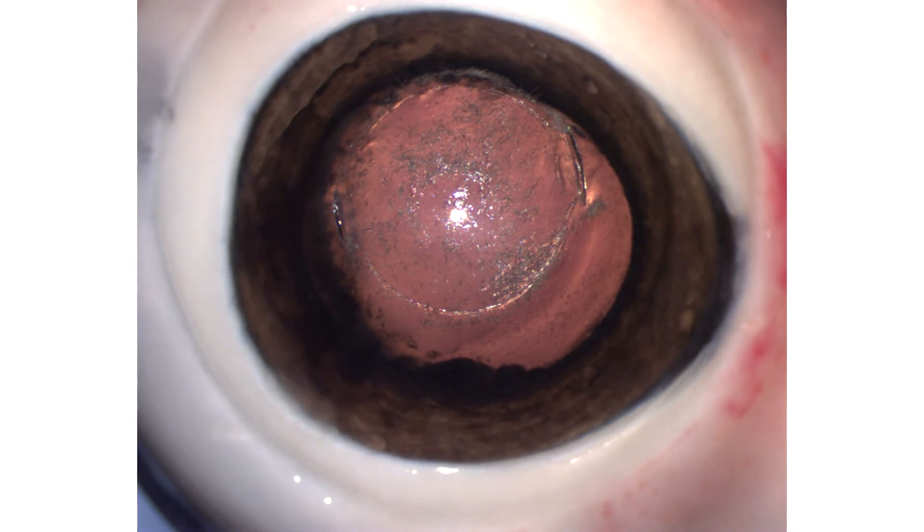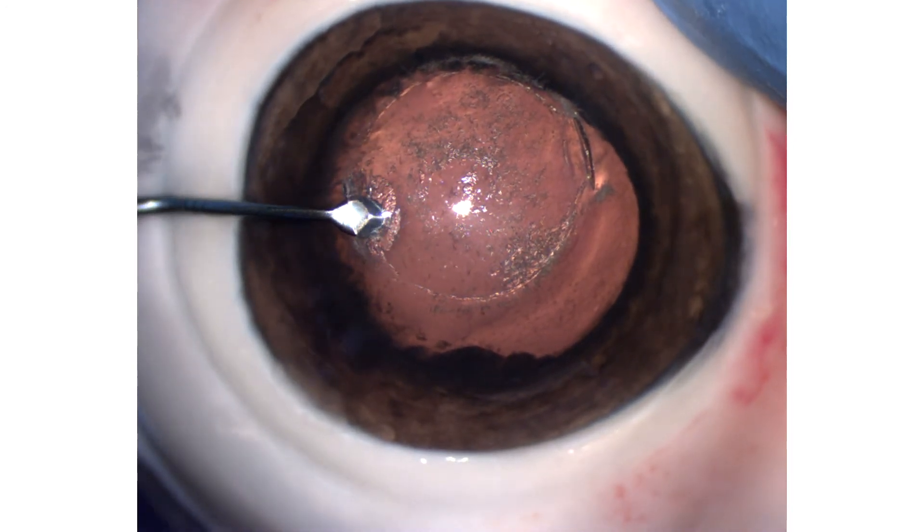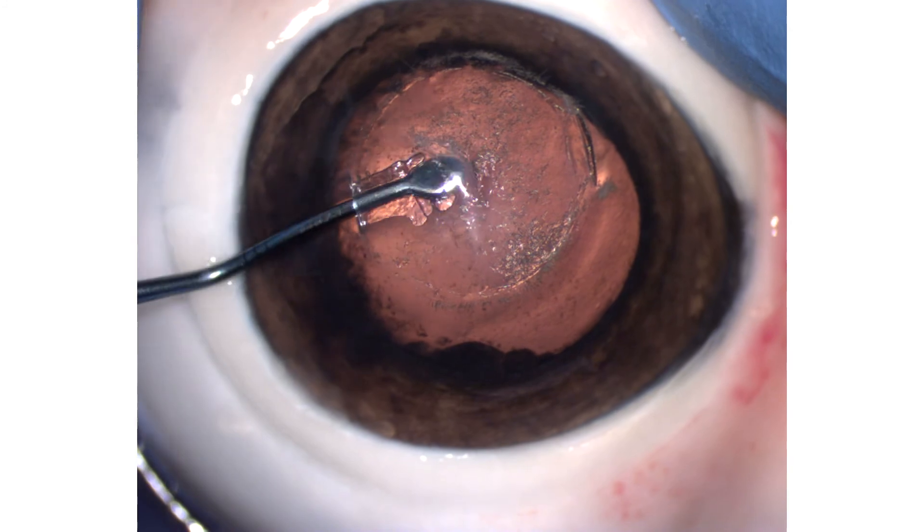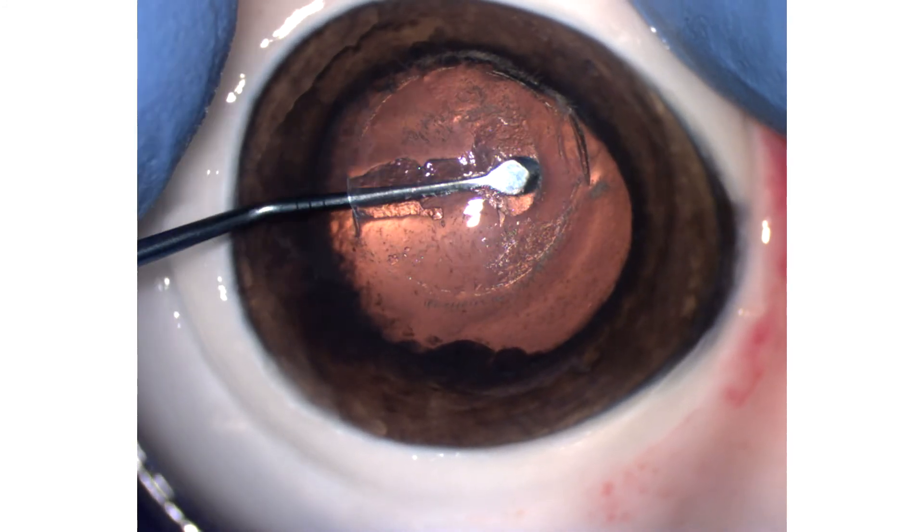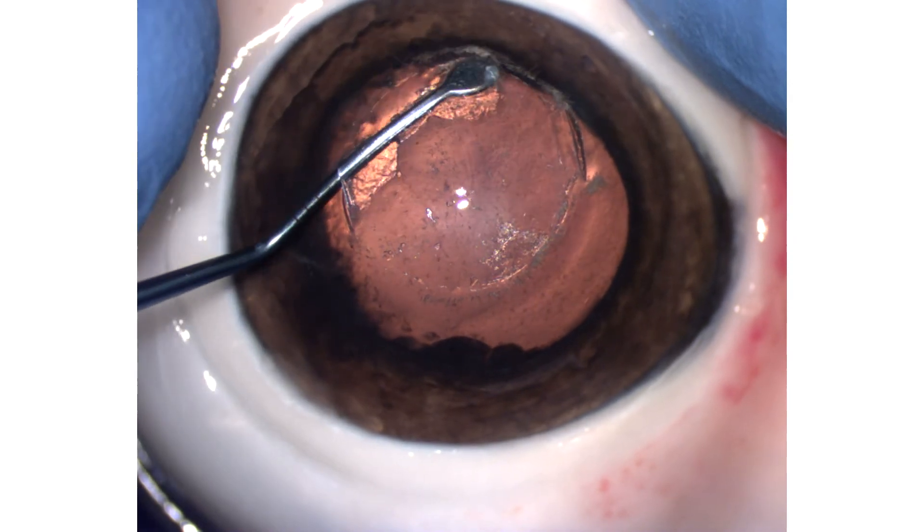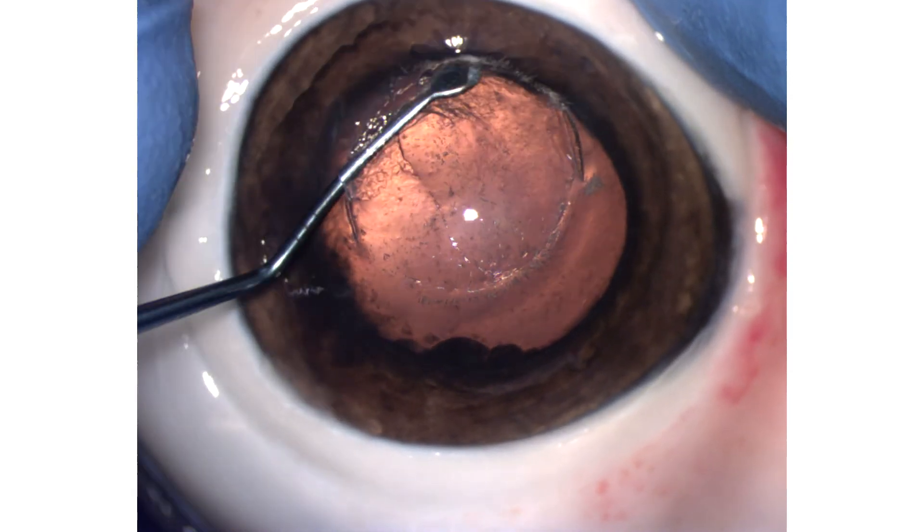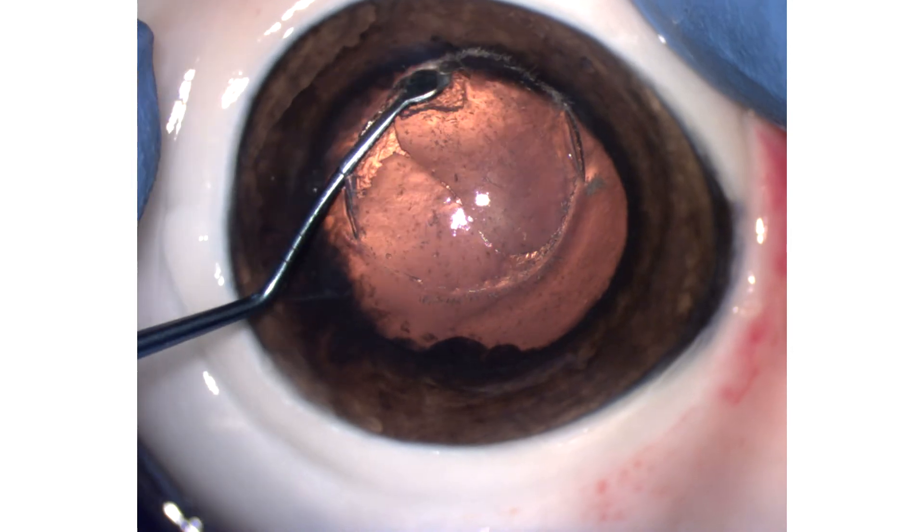Then I proceed in the same way with the anterior plane. I proceed with circular moves like that, and then I go until the edge to be sure it's detached.